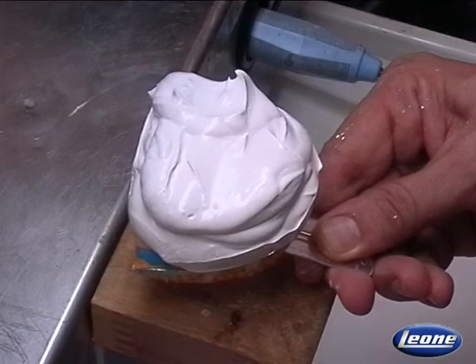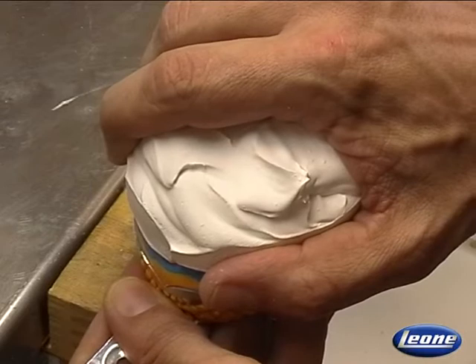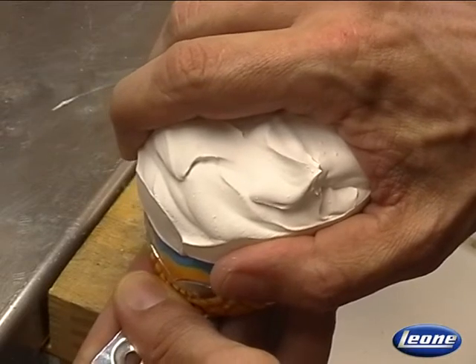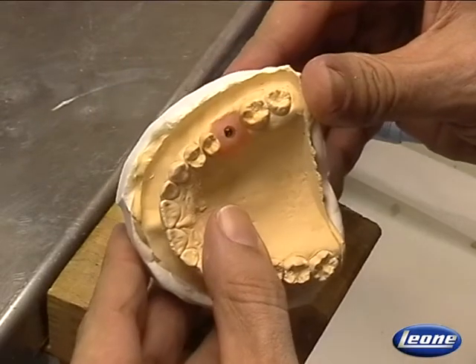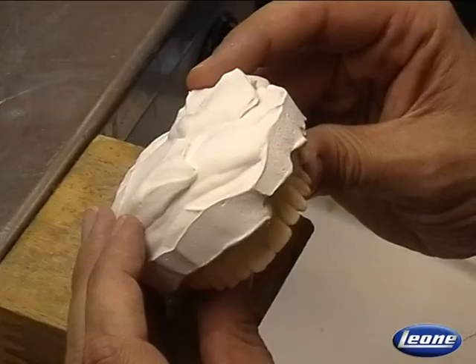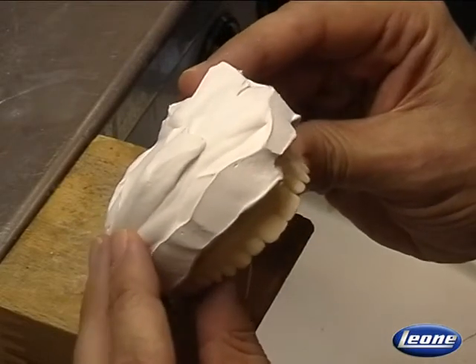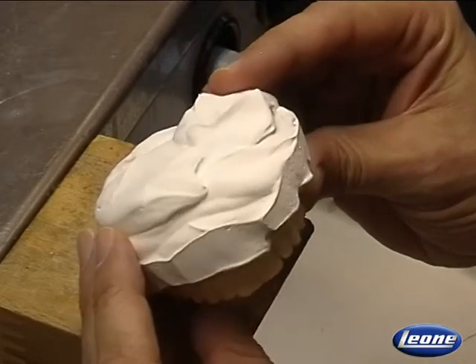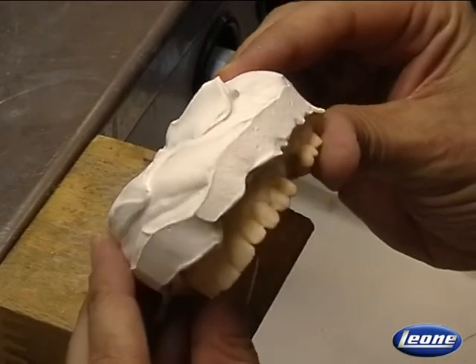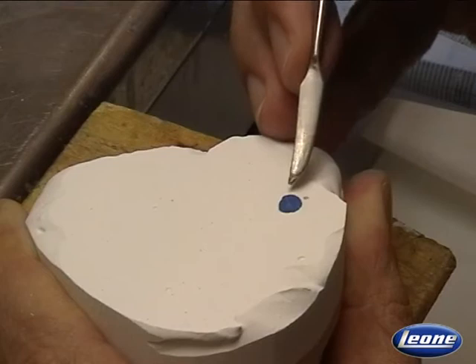At this point, we have to wait until the plaster has cured. Take care while removing the dental cast from the impression. Of course, you have to check that there are no imperfections. Now we have to smooth the cast until the wax over the pin is exposed. Once the pin is exposed, we have to remove the wax and the pin.